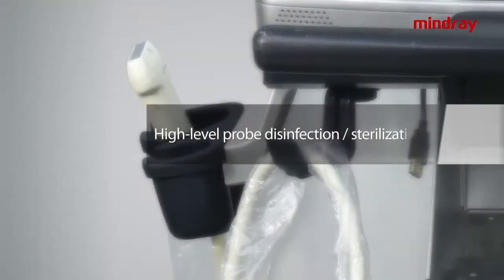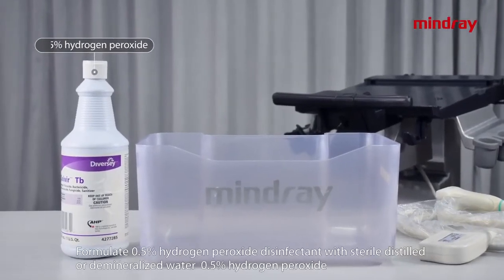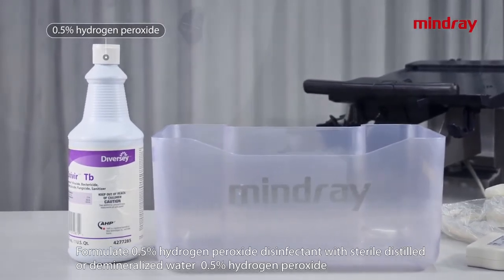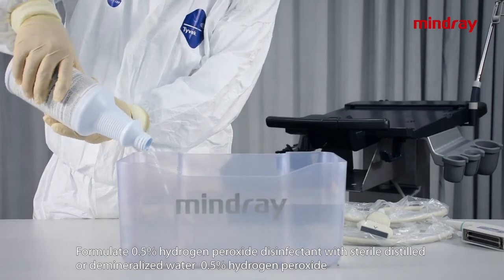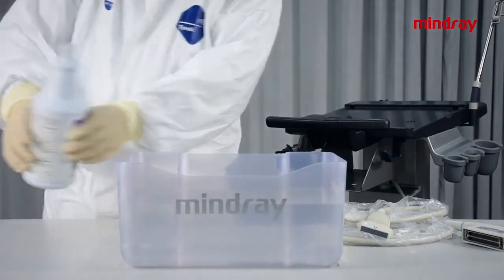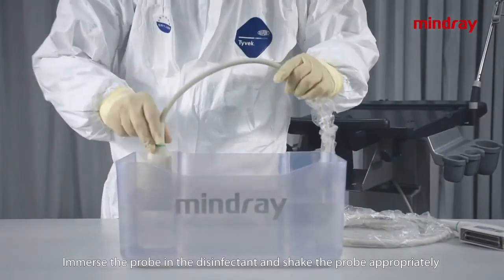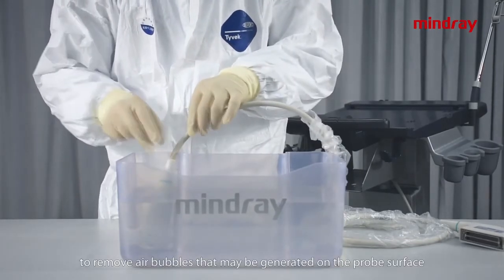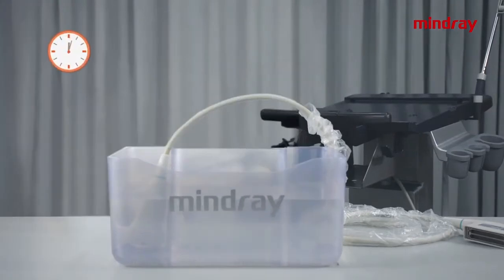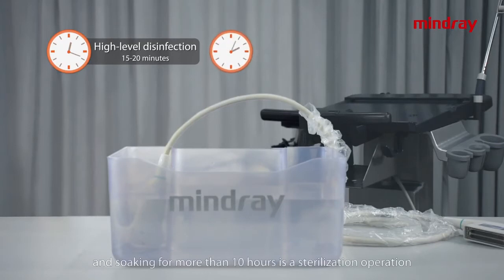High-level probe disinfection. Sterilization. Formulate 0.5% hydrogen peroxide disinfectant with sterile distilled or demineralized water. Immerse the probe in the disinfectant and shake the probe appropriately to remove the air bubbles that may be generated on the probe surface. Soaking for 15 to 20 minutes is a high-level disinfection, and soaking for more than 10 hours is a sterilization operation.